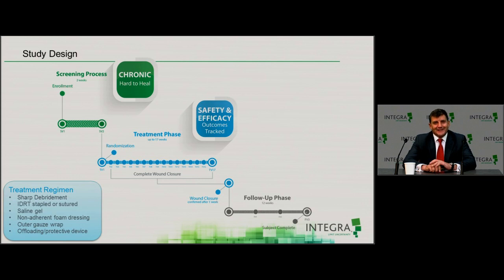But anyway, point is, actually it works better. Stapling helps you conform the IDRT into small foot wounds better than suturing. It is much easier. My residents, my fellows, and I personally feel so. And it turns out in the study that the patients who had it stapled, although it's not really talked about in the paper, had less loss of the silicone portion of the dressing. You can't talk about the rest. You can only tell the silicone, so we'll talk about that in a moment.